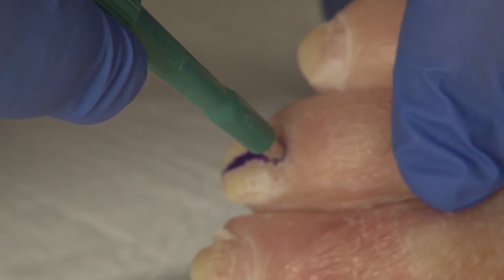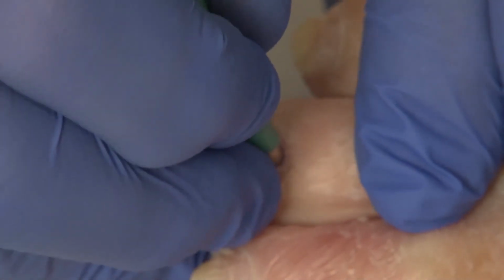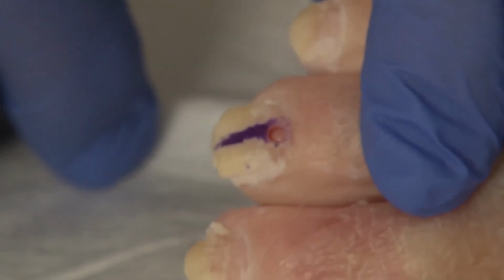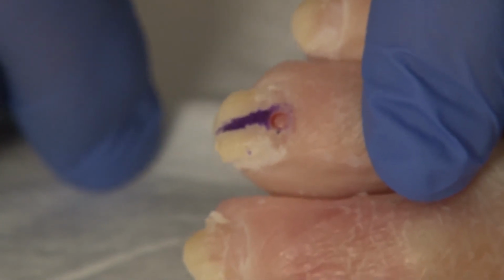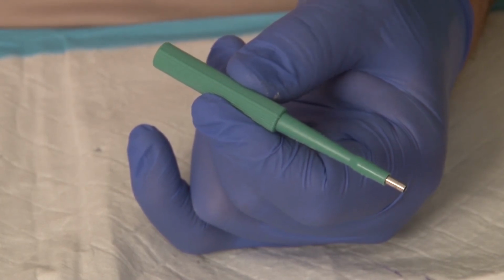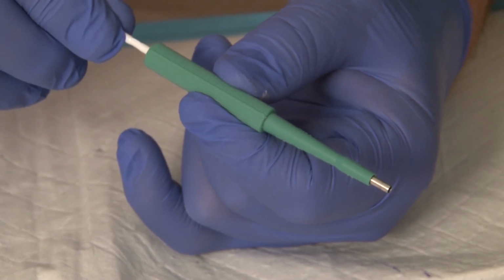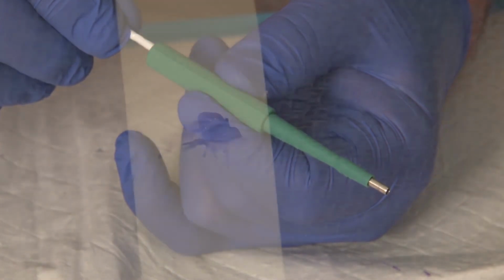The specimen is very firmly adherent to the periosteum, and to loosen it, we gently move the punch back and forth and then excise the specimen. The defect is then covered with a topical antibiotic ointment and a sterile dressing, and the procedure is concluded. To eject the specimen from the biopsy punch, you can use a sterile cotton tip applicator to insert into the hollow handle to push the specimen out, or you can use a punch biopsy device that has a plunger incorporated into the handle.